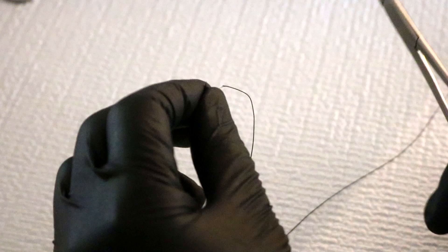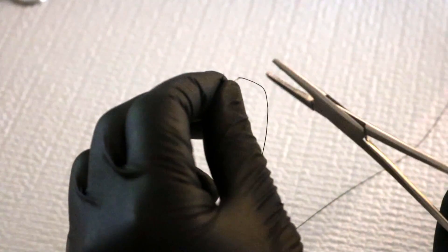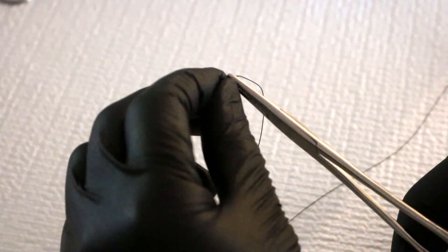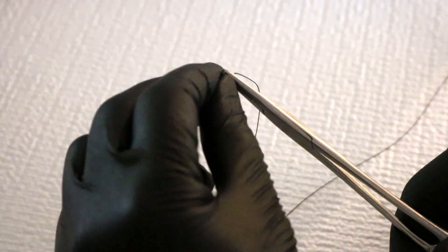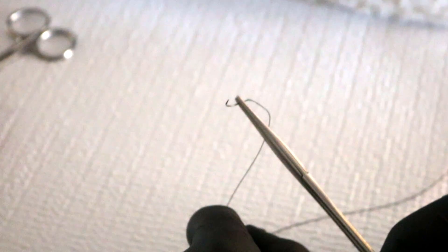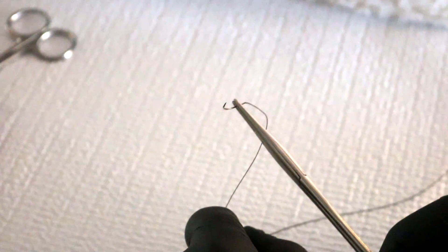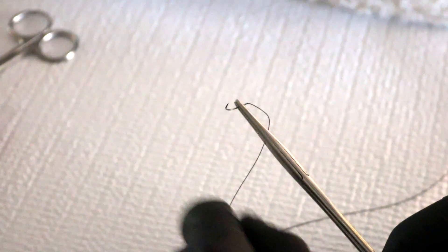Alright let's begin with loading the needle. When you load the needle, I'm holding the needle driver in my right hand and I'm gonna clamp down on that needle. I'm not grabbing at the very distal tip of that needle you see me pointing there because that's where the needle meets the thread and that's the weakest part of the needle so you want to grab about a third or more beyond that.